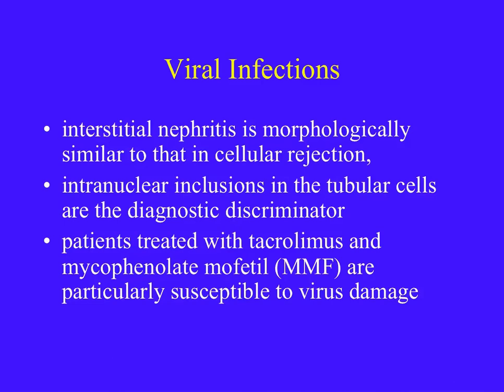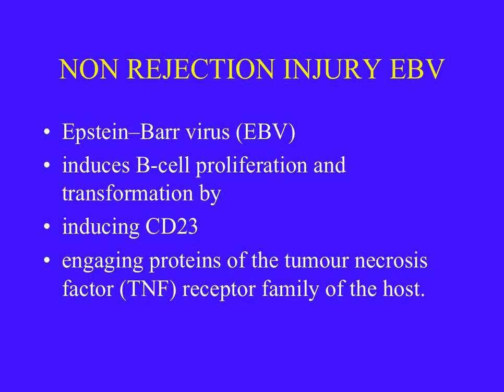The intranuclear inclusions in the tubular epithelial cells are the diagnostic discriminator. However, nowadays this is a rare phenomenon. Patients treated with tacrolimus and MMF are particularly susceptible to virus damage.